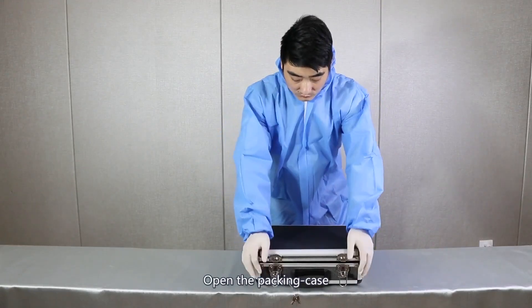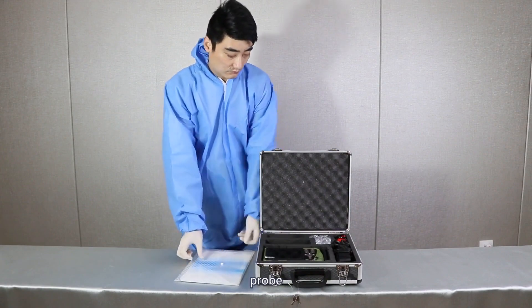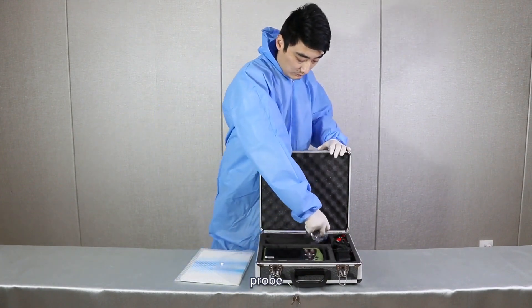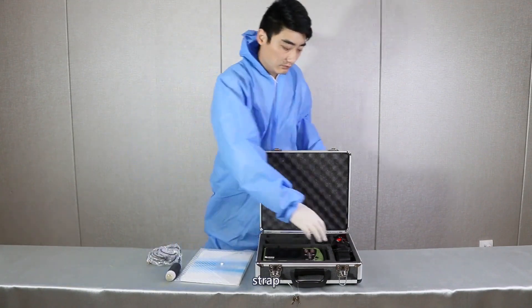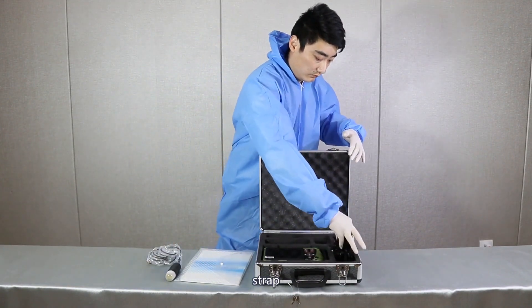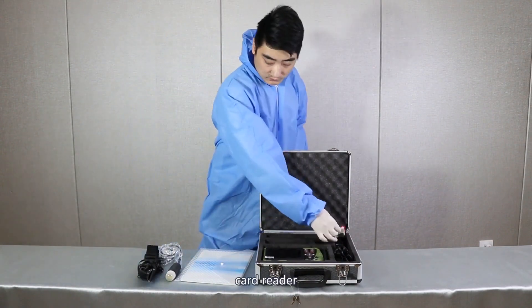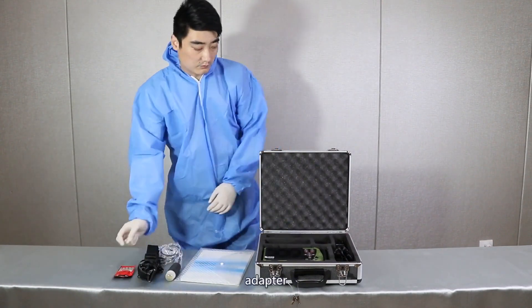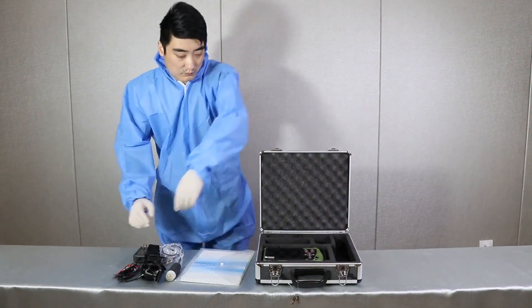Assemble demo. Open the packing case and take out the document, probe, strap, card reader, adapter, and a host.